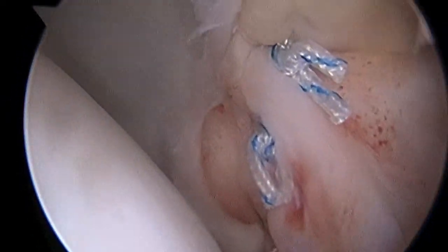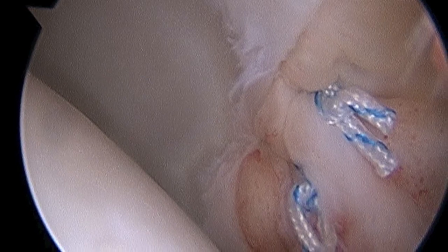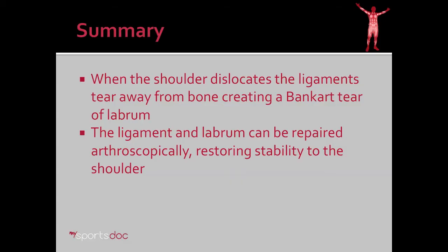Here you see our completed repair. In this case it was a four-anchor repair. Looking from above, you can see how the labrum and ligament has been reduced to the glenoid rim. Then we can look from behind, posteriorly, and probe our repair — and there's that nice bumper effect we like to see with arthroscopic repair. You can see our before picture of the labral and ligament tear away from bone, and here you see our repair once complete. In summary, when the shoulder dislocates, the ligaments tear away from bone, creating a Bankart tear of the labrum. The ligament and labrum can be repaired arthroscopically, restoring stability to the shoulder.